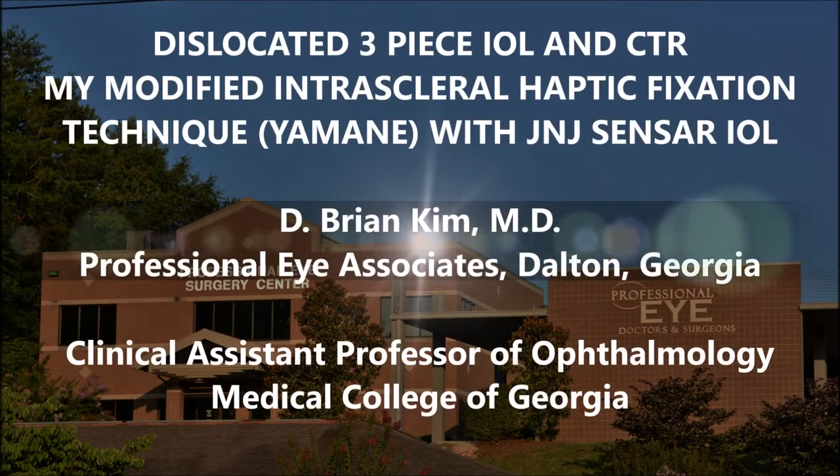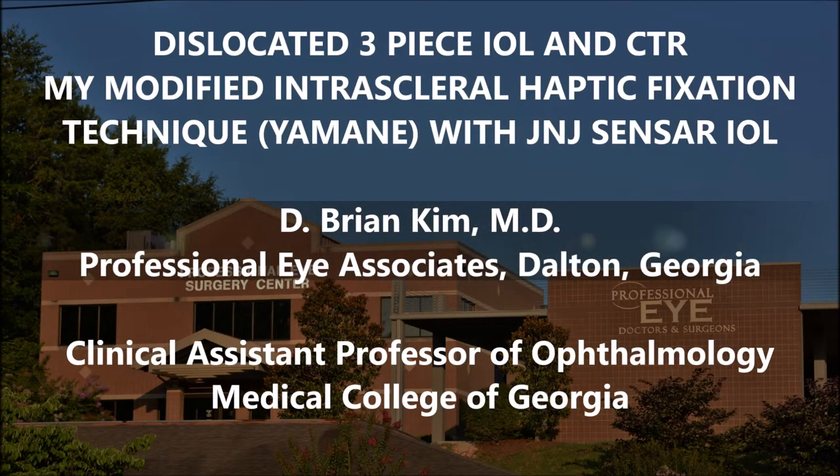Hi, this is Brian Kim. I'm going to share with you this case of a patient who has a dislocated three-piece lens and a CTR. I actually did his cataract surgery several years ago, and at the time of his surgery I sensed he had some weak zonules, so I put in a three-piece lens as well as placed a capsular tension ring. This case simply shows that despite those precautionary maneuvers, it didn't really matter.